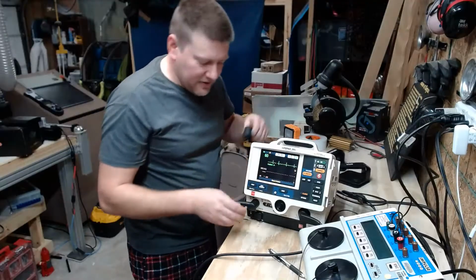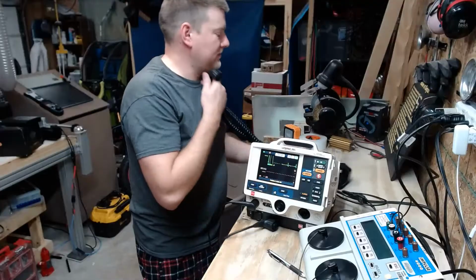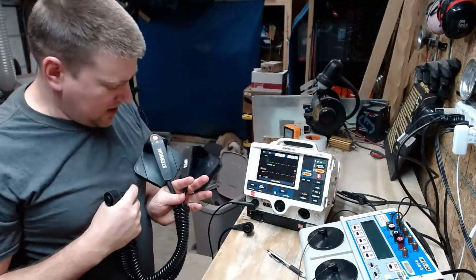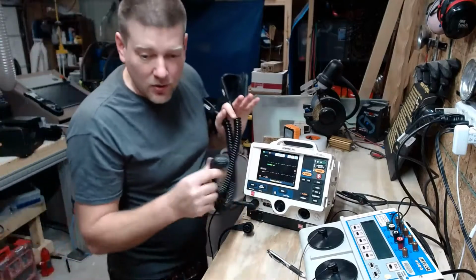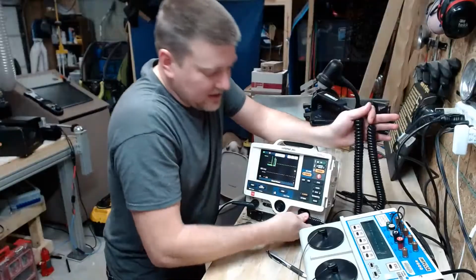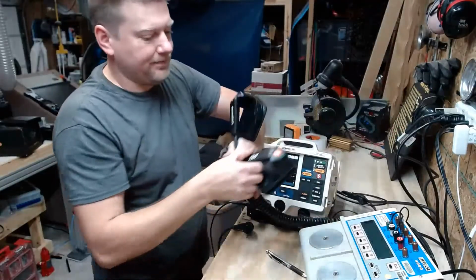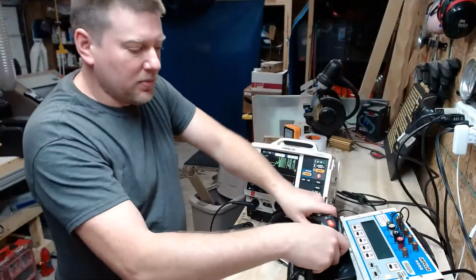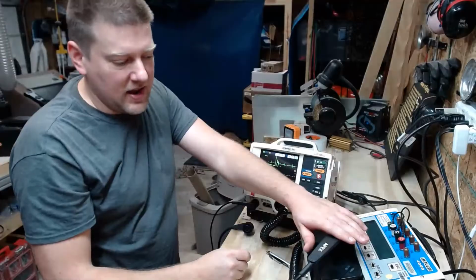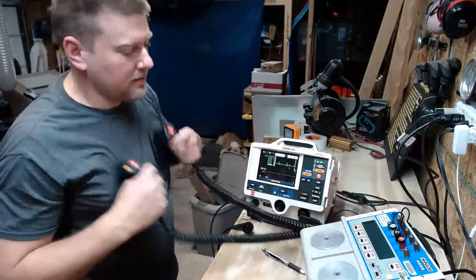One of the important things that we have to remember is these defibrillators also come with paddles. You can see they're labeled apex and sternum. So when we check out these defibs, we also are going to plug in the paddles, and that's why we pull these adapters off. And we put these defib paddles immediately on the analyzer. Direct contact, no gel, no nothing like that. Just put them straight on there.